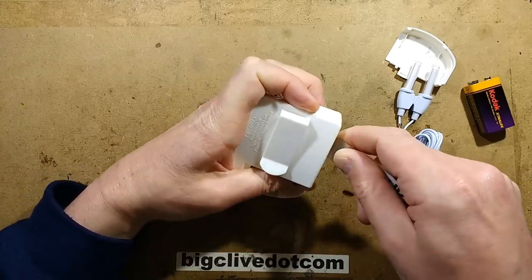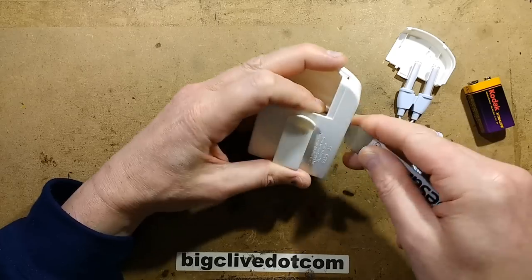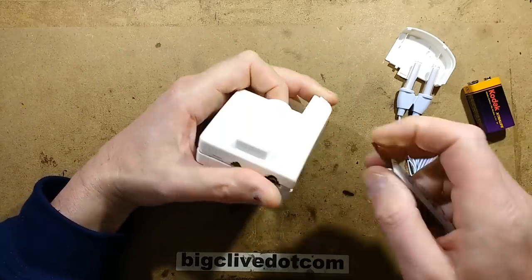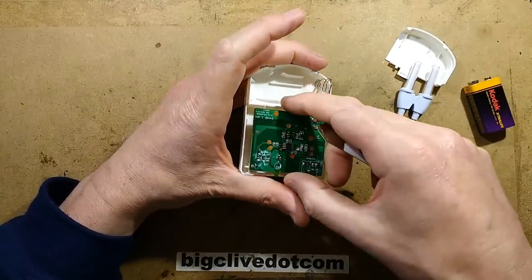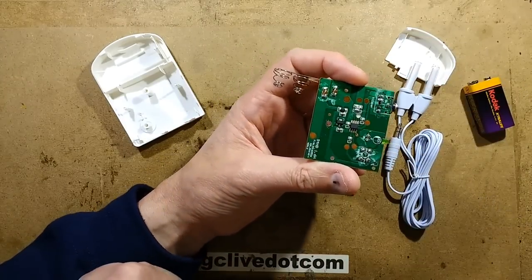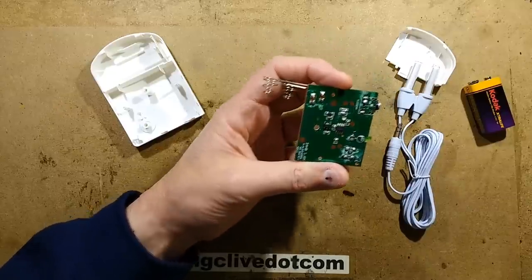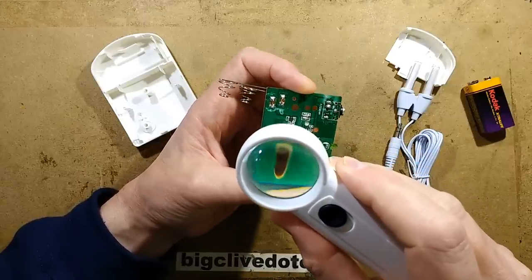That's reassuringly easy to open. Pride of place in the middle is a little 8-pin chip. I'm guessing that might be a voltage regulator. There's probably not going to be a number on the chip — and sure enough, the chip has no number. No surprise there.